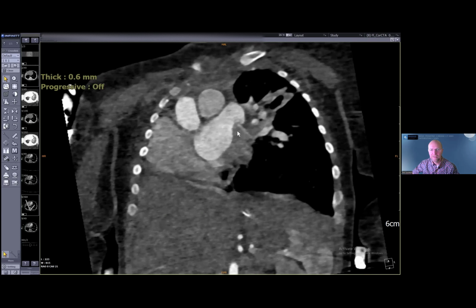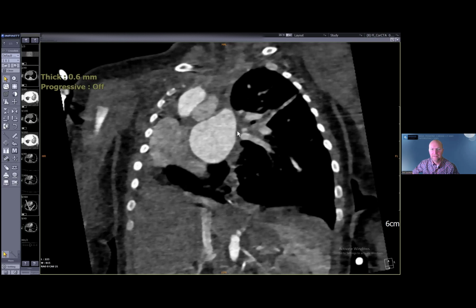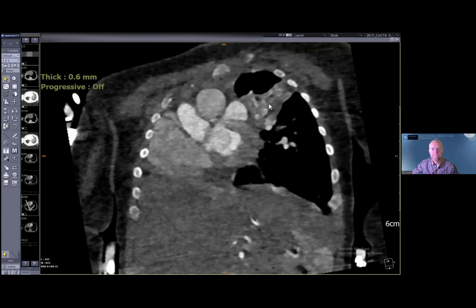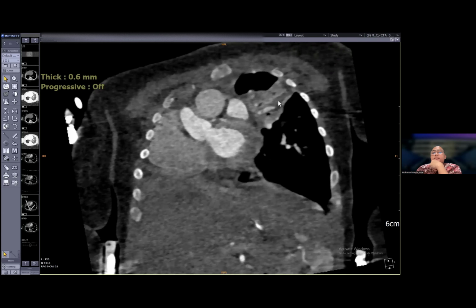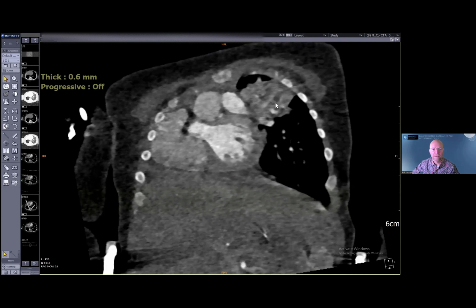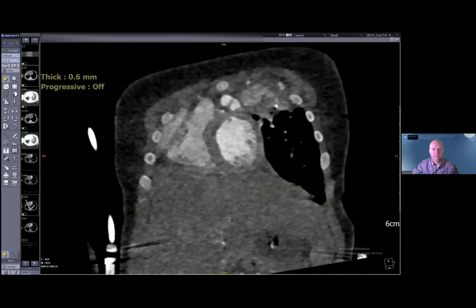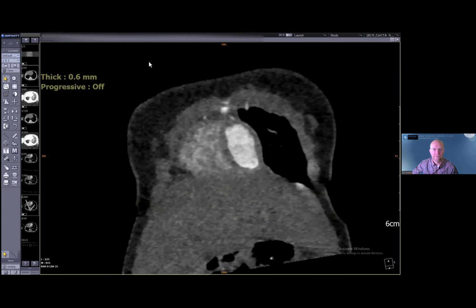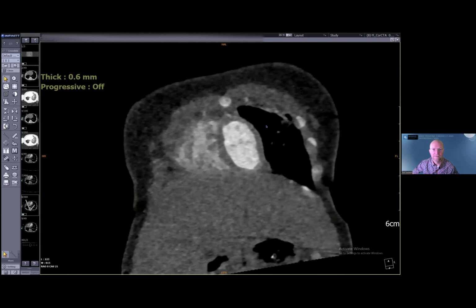The appendages, but see that left upper lobe area is very. Could you come all the way anteriorly, almost to the sternum? This one, I think some parts of that are very patchy, probably infection. Keep coming anteriorly. Yeah, the heart looks pretty good. Obviously rightward shifted because of the hypoplastic right lung.